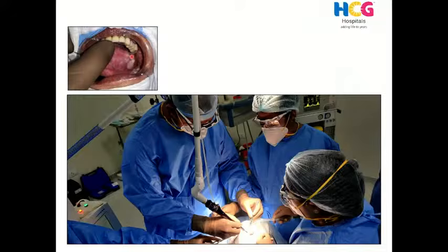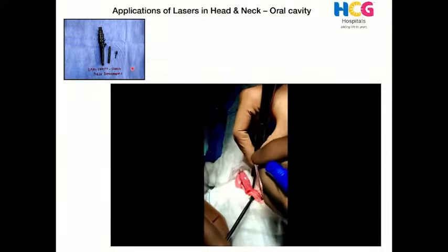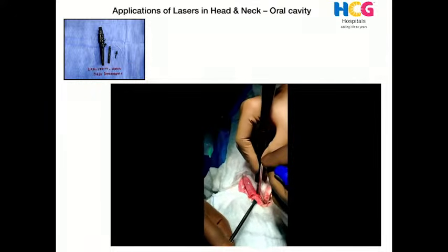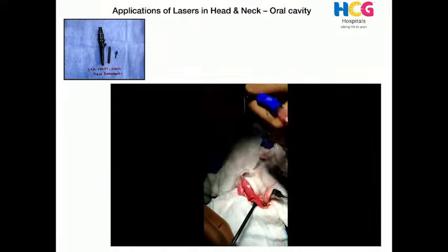So we have many discussions about whether to use a laser safe tube and all of those. But it's very difficult for me to talk on a panel where anesthetists are involved, because there is always a big debate on this. But we have evidence now with our own series of about 300 cases and our published series of about 70 cases, which Dr. Dinesh and team from anesthesia have done. When you stick to these basics of avoiding that triad, the laser is just more of a hype.